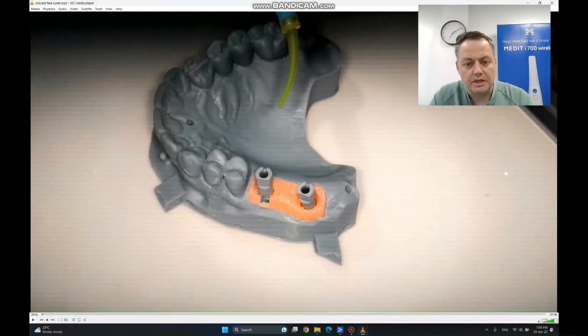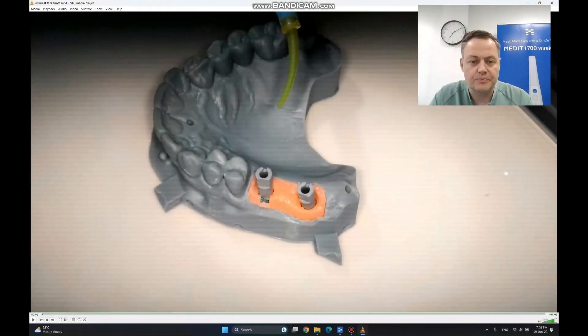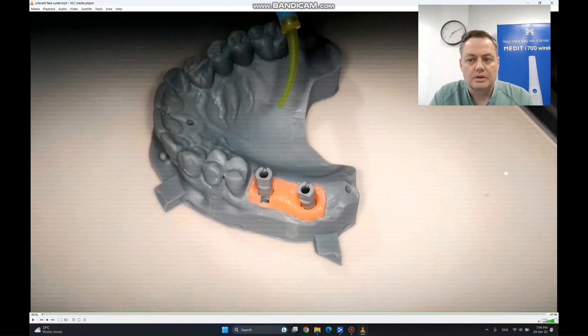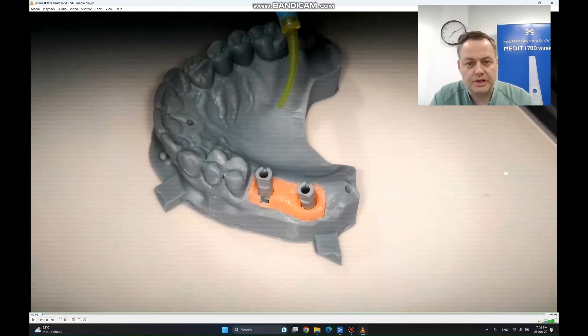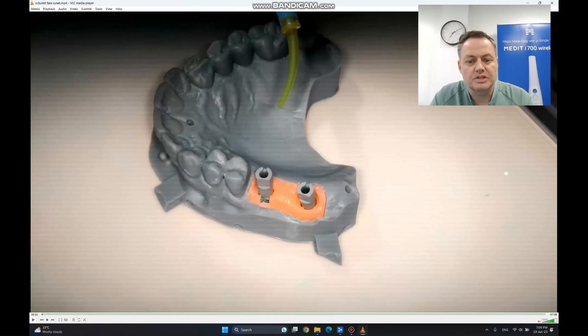Let's go to the second technique, that is comprised of using occlusal registration material with fast settings around the scan bodies.